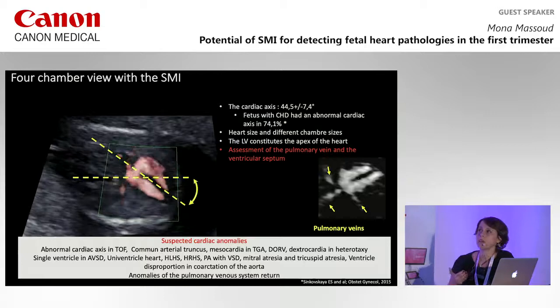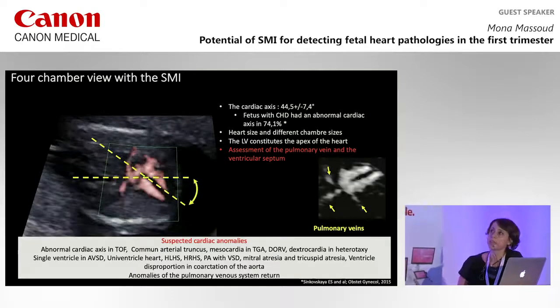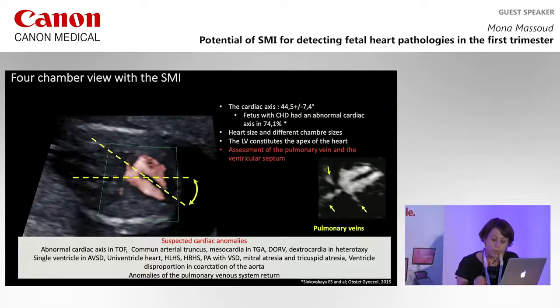We can suspect cardiac anomalies. If we have skills, we can propose a diagnosis, a prognosis, but maybe we are not in some pathologies able right now to give a precise and accurate prognosis at this time.